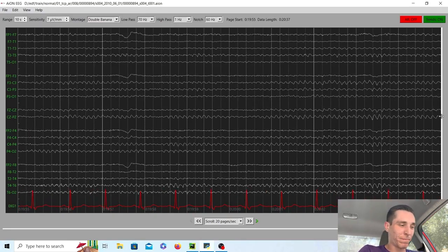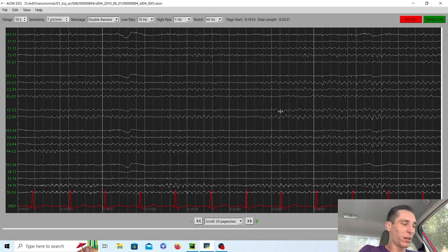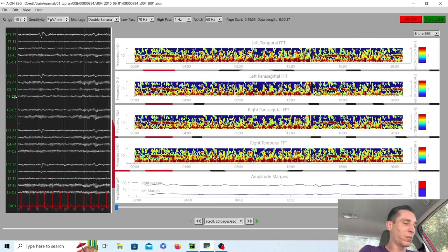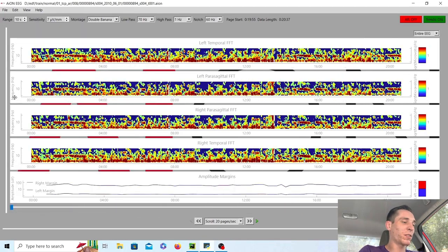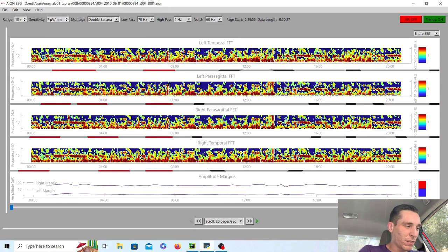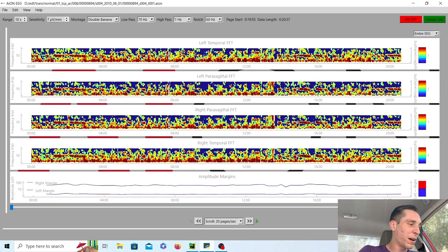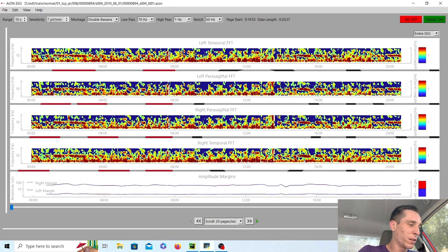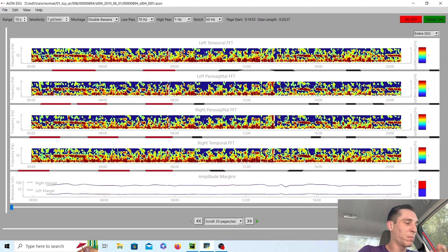And if you want to look and tell your sleep structures on the trends tab, you can see, well, let's first find the background. The background we said was nine. Here's 10. So you're going to see the stripe right at 10 or about nine. So that is your posterior dominant rhythm right here. And all of these four different things, these panels are going to be the same because it's symmetric. So that is your background.